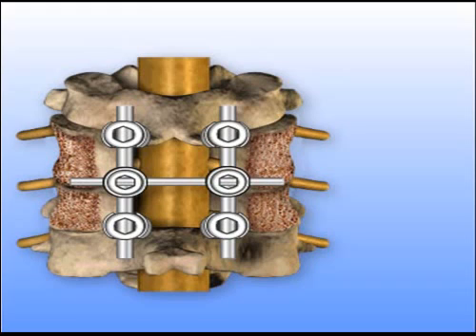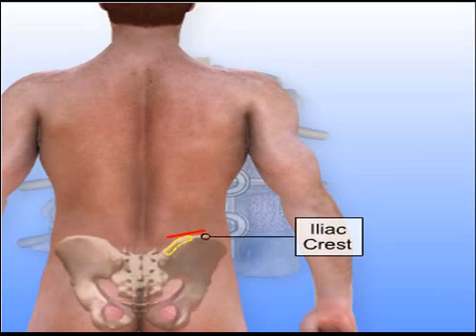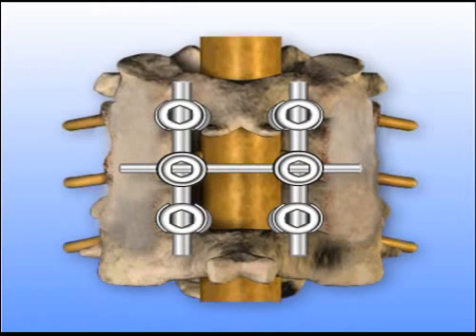Bone grafting can be done with pieces of a patient's own bone, processed bone from a bone bank, or a bone graft substitute. To harvest a patient's own bone for grafting, a second incision is made over the back of the pelvis. Bone is removed from the iliac crest and placed along the prepared site where the top layer of bone was removed. This bone eventually grows in place, fusing the spine and providing additional stability.